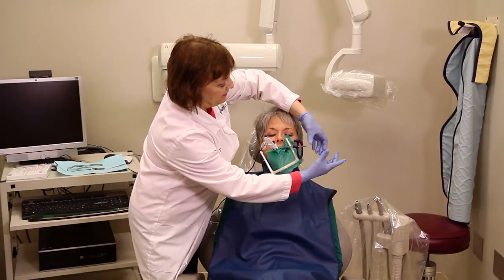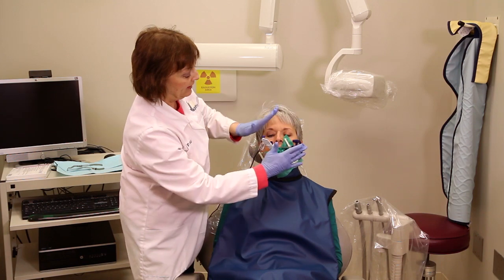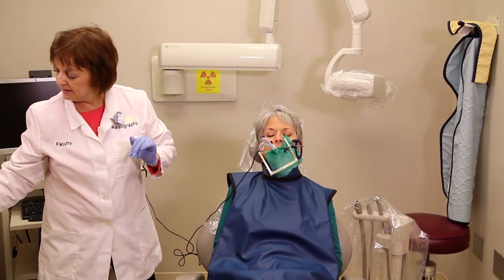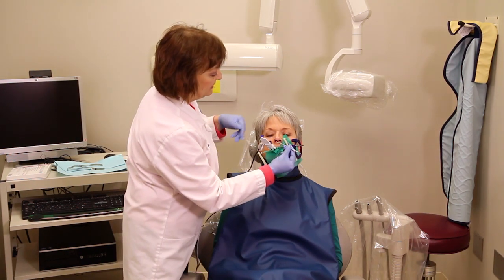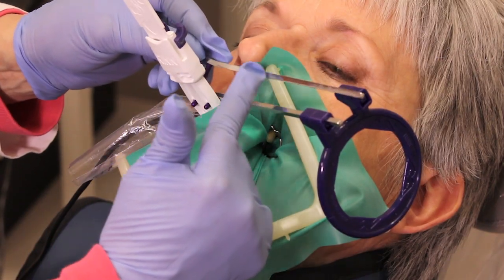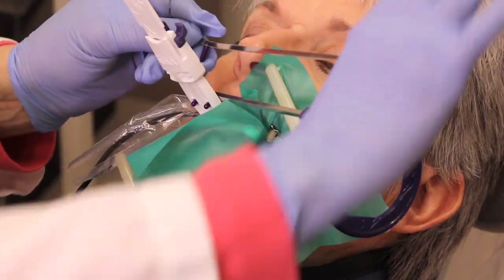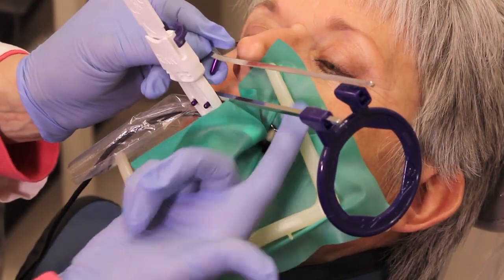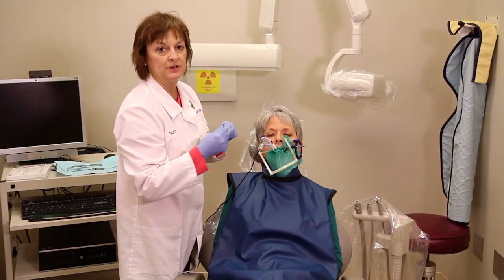You bring your tube in and follow the bar. Many times though, when you're doing a tooth up there, you miss the root tip. So what you want to do is use one of the angled bars that come with the kit and place that in instead. You can see it's got a 15-degree angle upward to actually bring your vertical tube angle a little higher, and this will actually be able to include the root tip for sure.